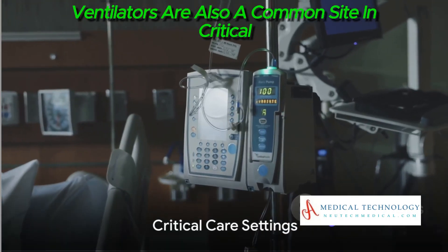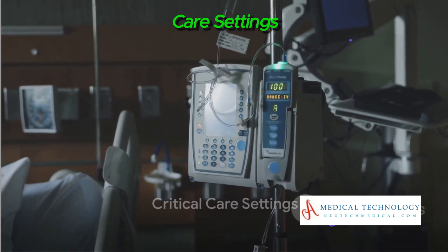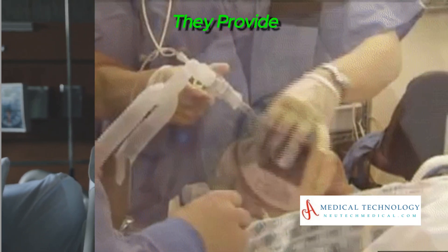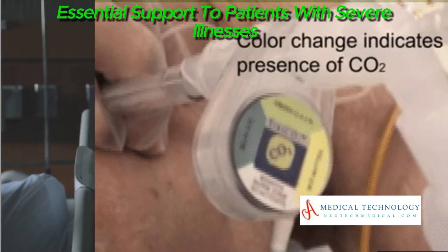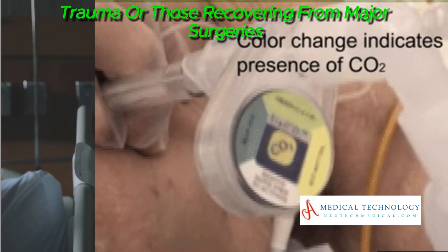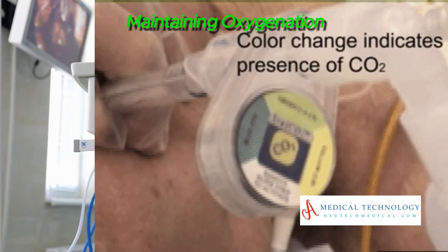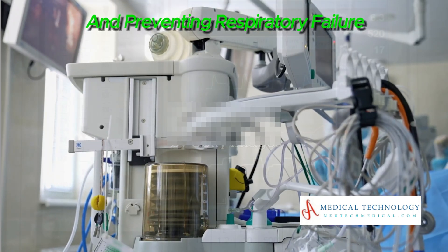Ventilators are also a common sight in critical care settings such as intensive care units. They provide essential support to patients with severe illnesses, trauma, or those recovering from major surgeries, maintaining oxygenation and preventing respiratory failure.